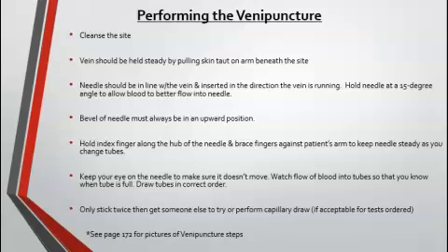But you want to hold the index finger along the hub of the needle and brace your fingers against the patient's arm in order to keep the needle steady. Especially when you're changing tubes, if you're having to collect multiple tubes within a blood draw. Another tip to help keep the needle steady is to keep your eye on the needle to make sure that it doesn't move.